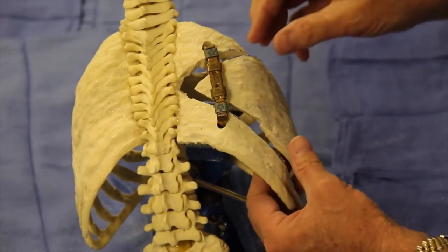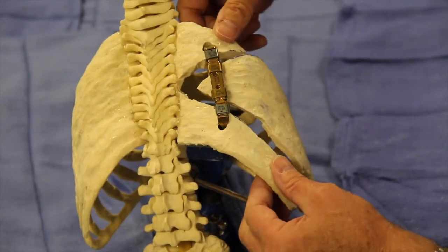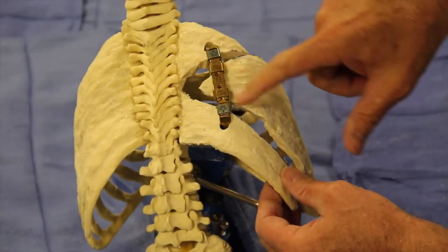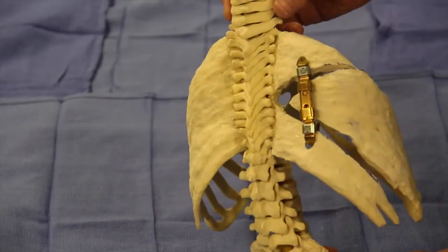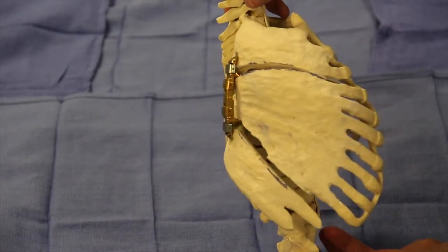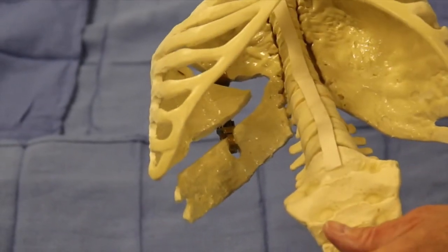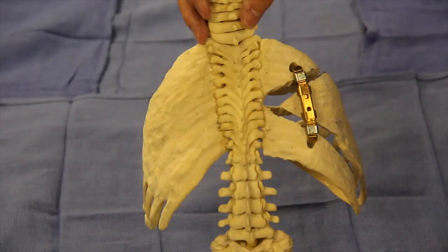The procedure is now complete. As you see, the thorax is expanded vertically. There is some lateral expansion, and the thorax is enlarged to some degree. Inside it is very low profile, as well as posteriorly.